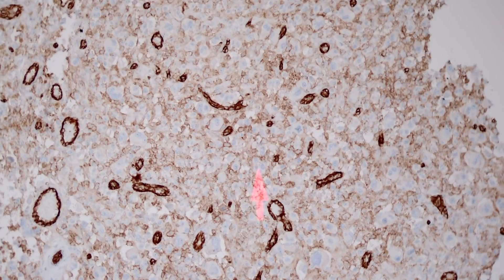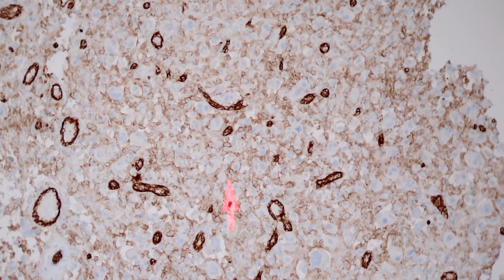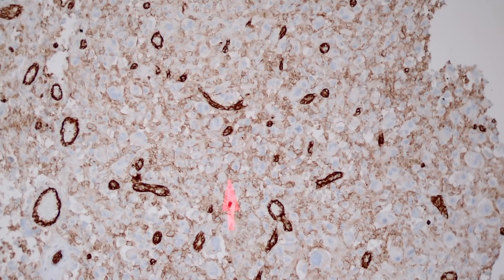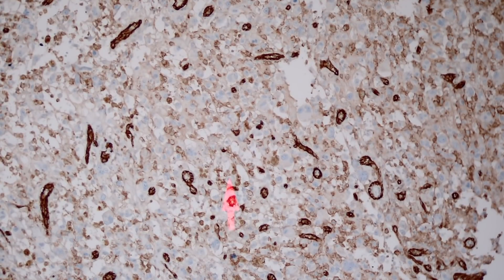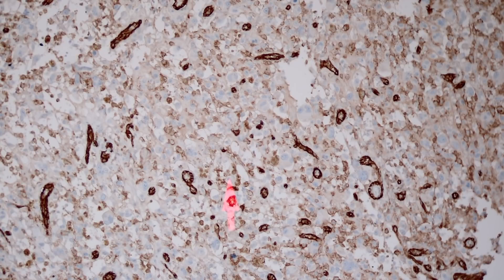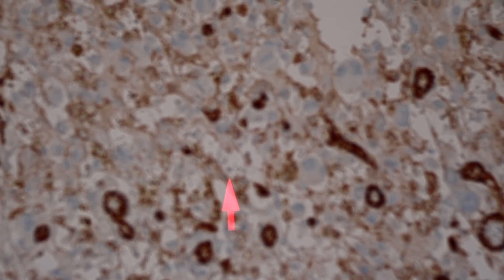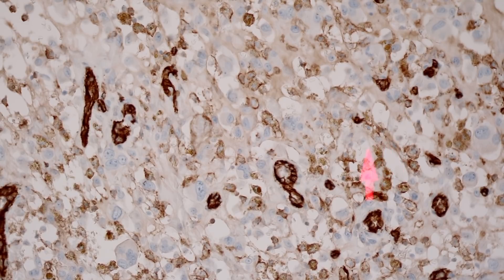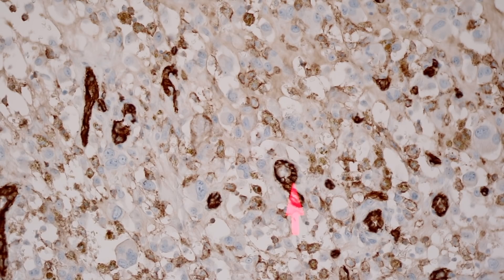The point here is that even this amount of staining is not indicative of endothelial differentiation. This is histiocyte staining plus some blushy staining on tumor cells, and it's nowhere near as strong or crisp as the background endothelial cells in adjacent blood vessels. You can always use those normal vessels as your internal control when assessing whether a vascular stain like CD31 is truly positive.